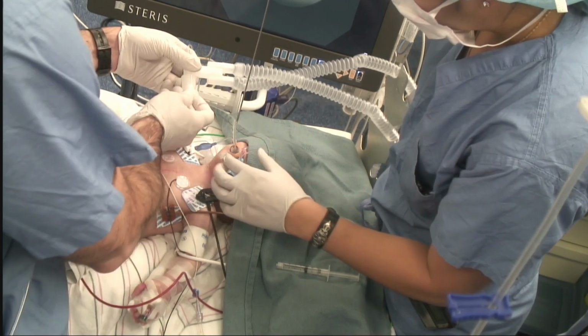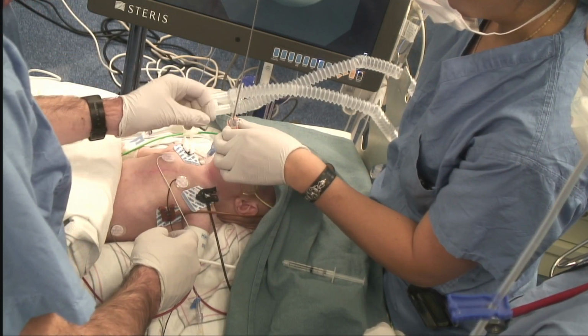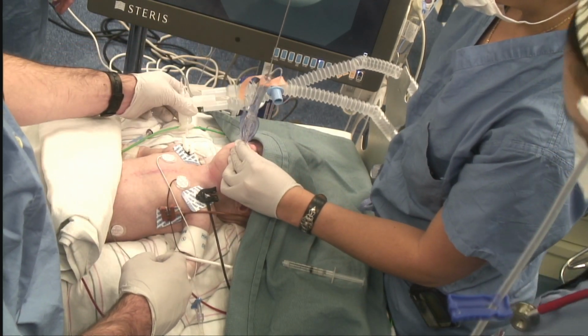Recall that supraglottic airway devices are designed for intubation, such as the AirQ in this video. The tube is already in proper position in the trachea, such that the tube holder is used to stabilize the tube as the airway device is removed and not to advance it further into the trachea.